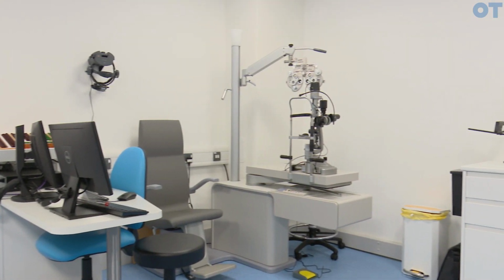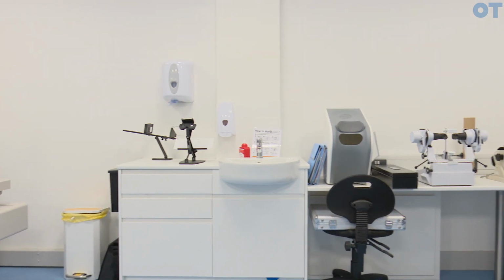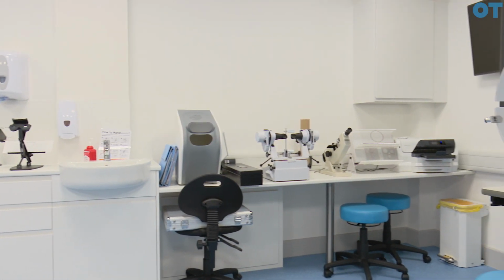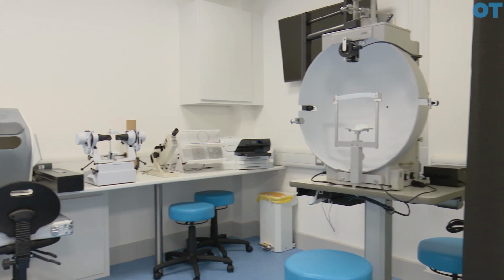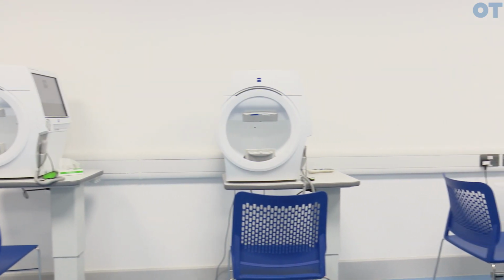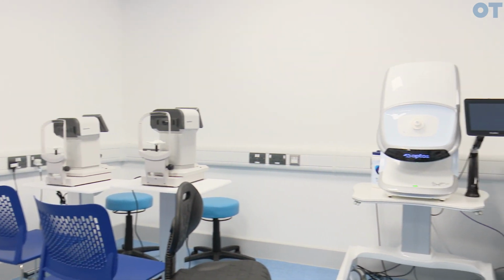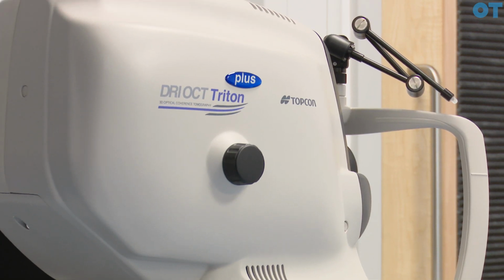testing. We also have a 6-metre bay, so that's a full-length examination bay, which gives us that extended scope of potential practice, especially with the younger children who have accommodative anomalies and can sometimes relax with accommodation. It gives us that alternative to the first movement towards cycloplegics. So in addition to our standard threshold and suprathreshold visual fields and intraocular pressure testing, we have an Optomap ultra-wide field imaging system. We also have a swept source optical coherence tomographer. So we have those sort of advanced diagnostics as well.